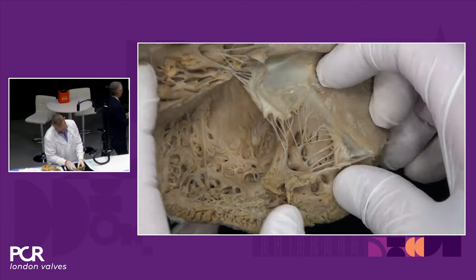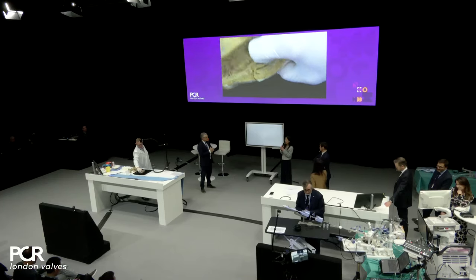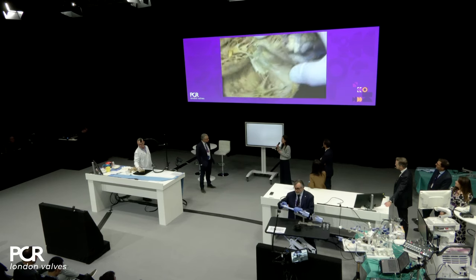Okay, so what did we learn from this case now? Yeah, I think what I've taken home the most is respecting the symmetry of the anatomy, trying to cross in chordae-free zones to avoid entanglement, and having the range of clip sizes to be able to tailor to the anatomy here. But certainly, symmetry and respecting the anatomy were my key messages from this session.